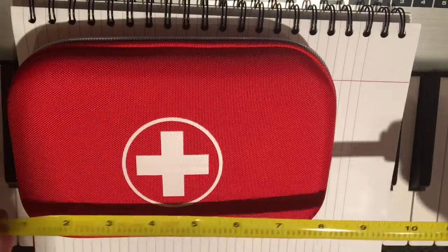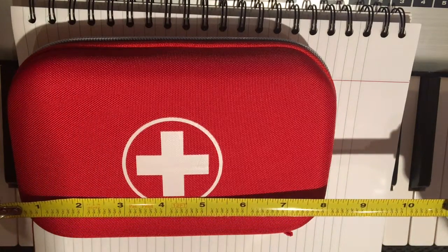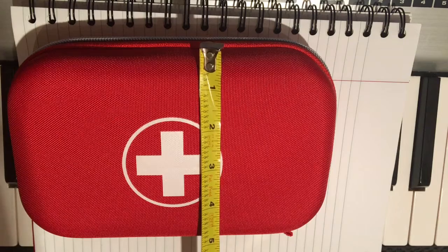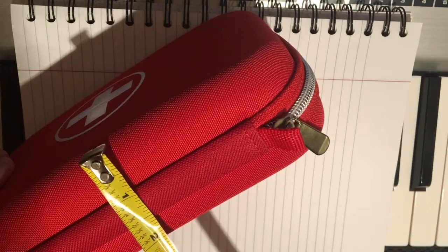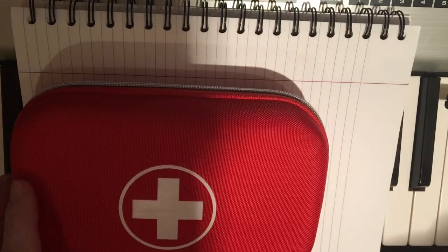I'm going to give you a quick look at the hard case that it has here. You'll notice that it's about eight and a half inches across, about five and a half inches this way, and it's pretty thick — about two and a half inches in width. The case looks really nice, and let's see what's inside.